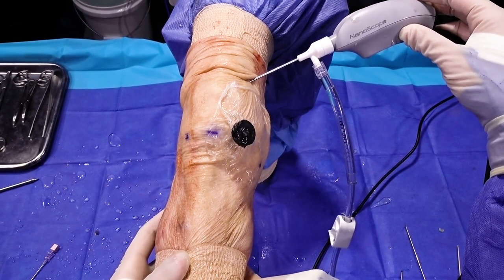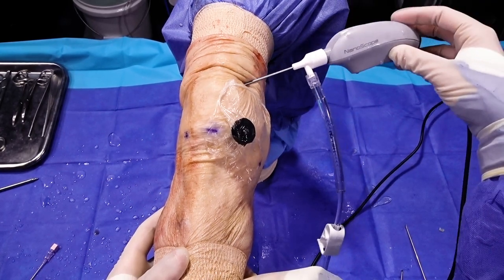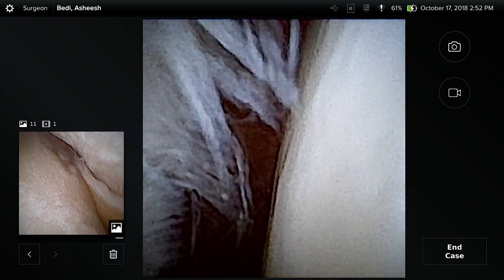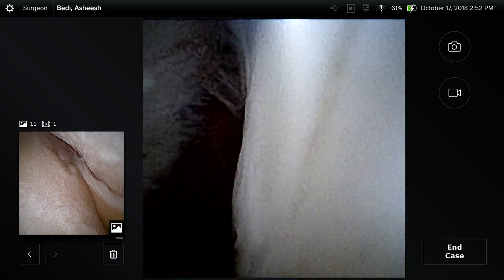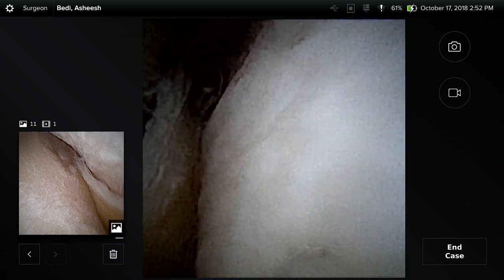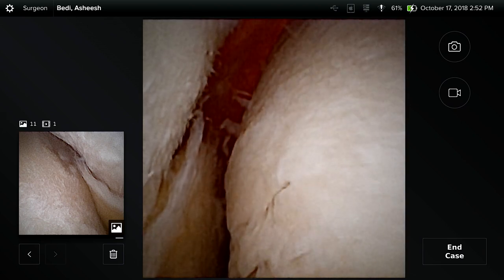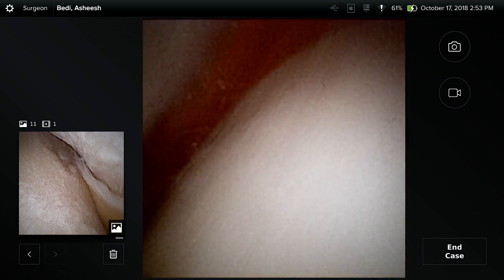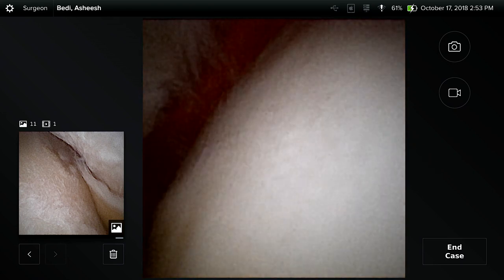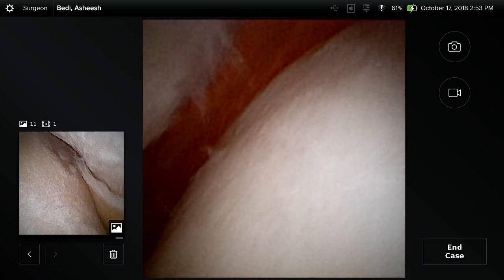Now through a supra medial portal just deep to the vastus medialis, this gives a very unique vantage point and perspective. You can see all the way down the trochlea in deep flexion and extension — we can see the patella and the medial facet engaging. This is a great view for looking at medial patellofemoral compartment disease, assessing tracking, and assessing patellar tilt and alignment after an MPFL procedure. In fact a nanoscope would allow us through a needle to inspect alignment without performing a full arthroscopy.